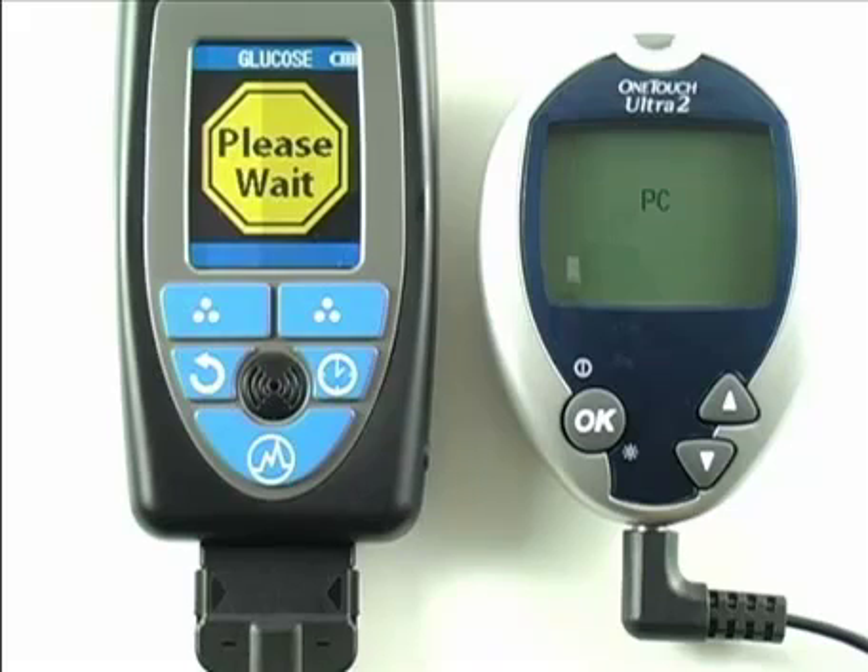After that takes place, the HealthPal begins its transmission sequence sending the data to the MedApp Central server. The HealthPal will display a series of visual cues designed to help assure that the HealthPal is communicating the reading successfully: connecting, transmit data, transmit OK.